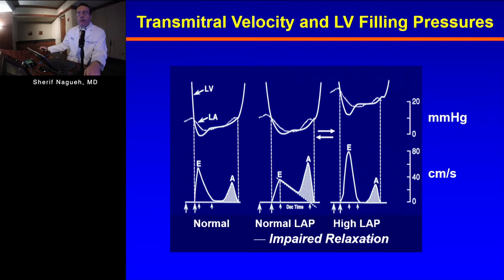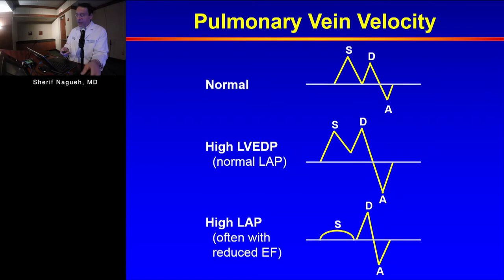The point I want to emphasize is these inflow patterns are not interpreted in vacuum. Before you start drawing conclusions using the inflow patterns, you want to look at the clinical history and also the findings that you see by 2D echocardiography, as we will get into that.